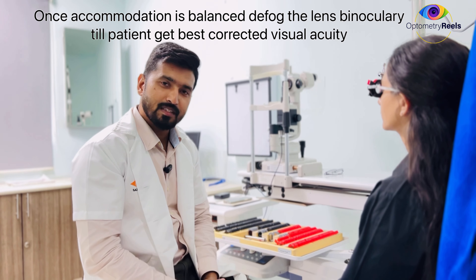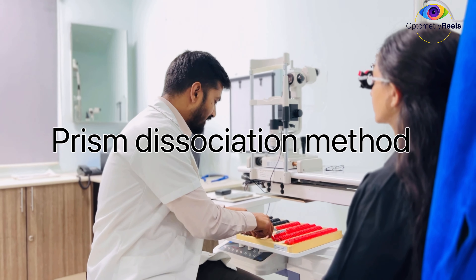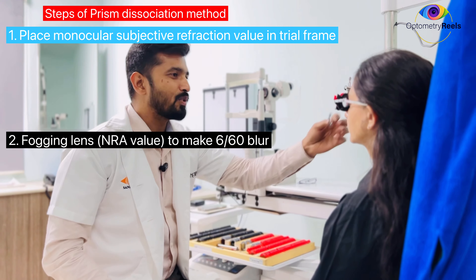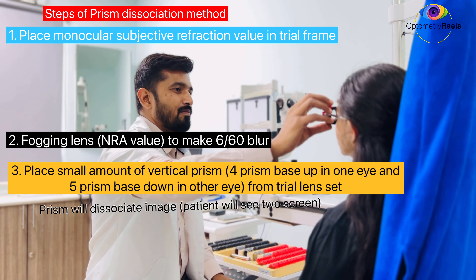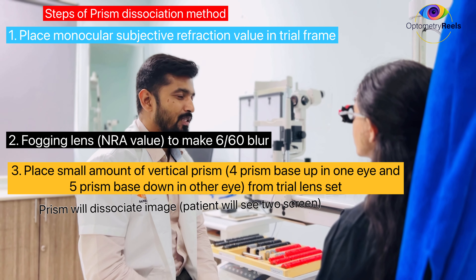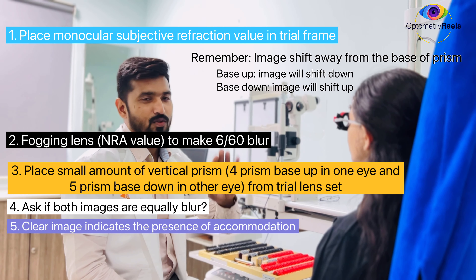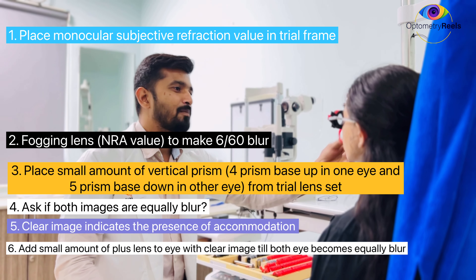Usually we use maximum plus and minimum minus. Now I will talk in more detail about the prism dissociation method. To dissociate the eye, we use a vertical prism — a small amount of prism. I am going to put a base-up prism in one eye and a base-down prism in the other eye. Can you see two screens or two sets of letters? Yes. Which of the two is more clear, or are they equally blurred? The lower one is more clear. Lower one is more clear — and the lower one has the base-up prism, which suggests the right eye is still accommodating.